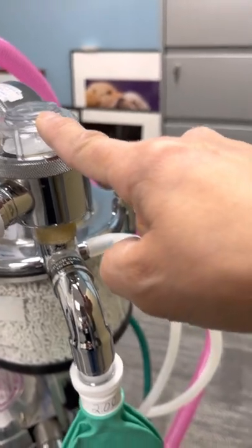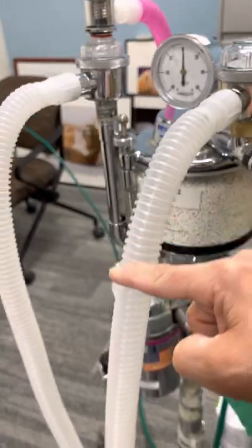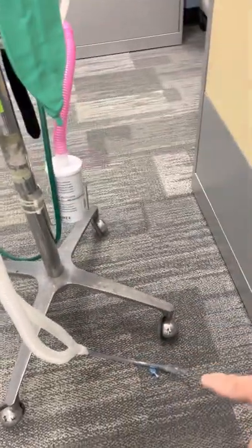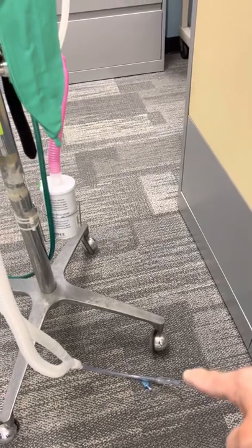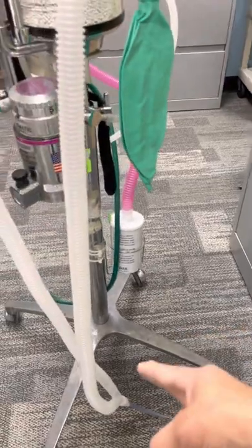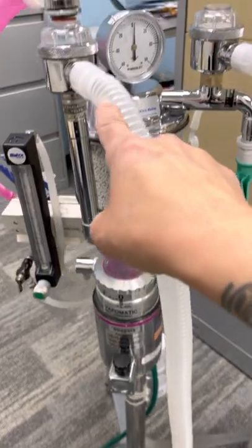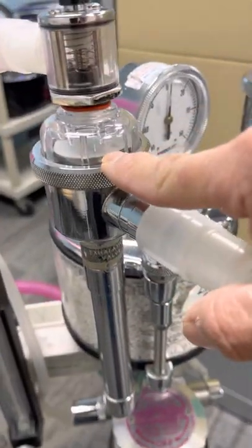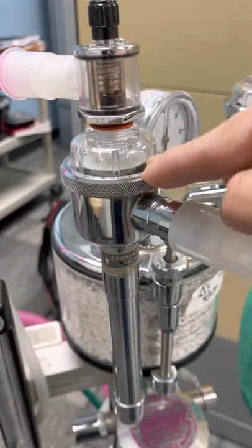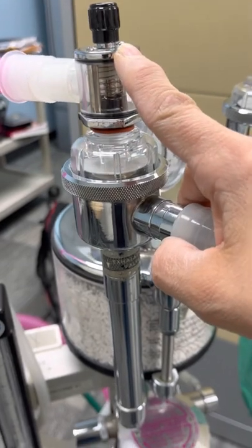This is a one-way flutter valve, so it's just gonna allow this gas to go straight to the patient through our Y tubing, goes through our endotracheal tube, then the animal, you know, inspiratory, then expiratory, so the gas is now coming out, and it comes to the other side of our Y tubing up here. Another one-way flutter valve, so that closes so that the gas doesn't go the wrong direction. It only allows the gas to come out. And this is called our pop-off valve.